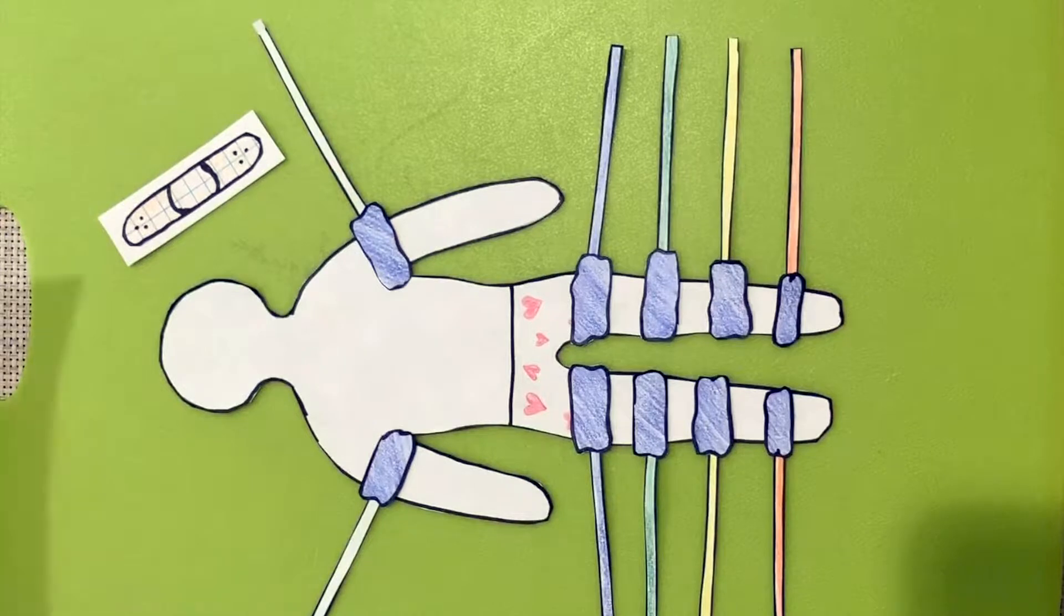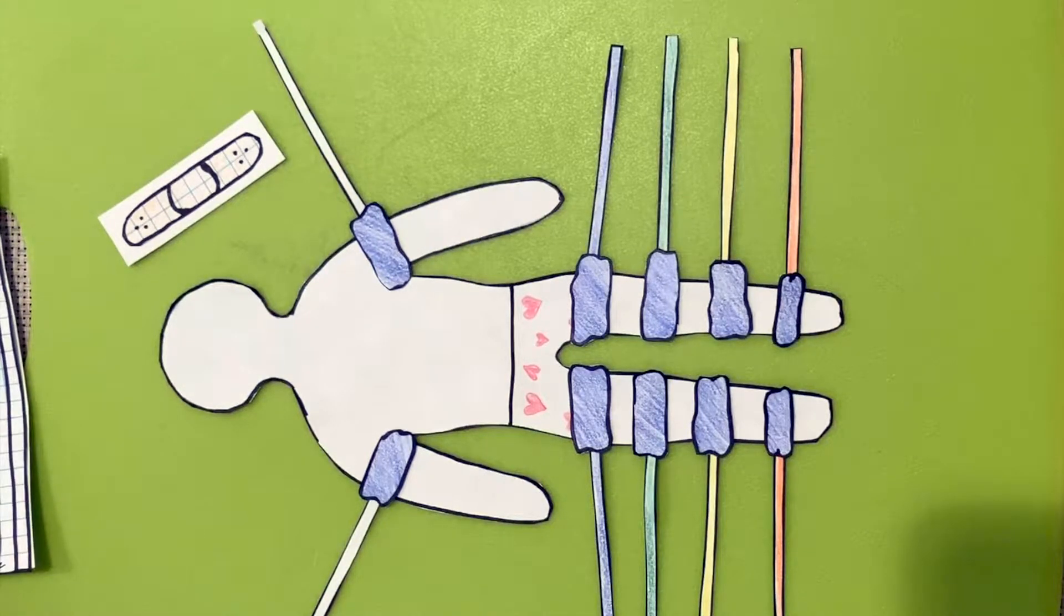The process is relatively the same all the way up the leg. I say up the leg because after the brachial pressures are taken, the next step is to locate the dorsalis pedis artery between the two ligaments where the leg meets the foot or between the great toe and second toe on the right leg.